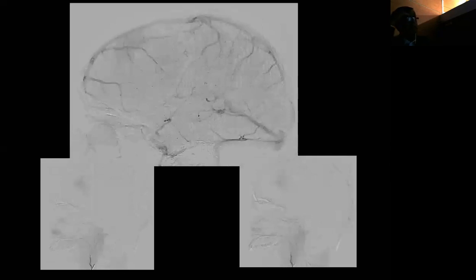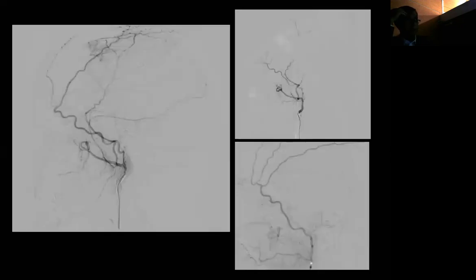We can see here the late phase on the venogram. In the late phase, you can see the spaces of the blush. In some of the images it probably shows some necrotic part of the tumor centrally. Maybe this is why we have such a delayed blush still staining the meningioma. These are the feeders from the external carotid.